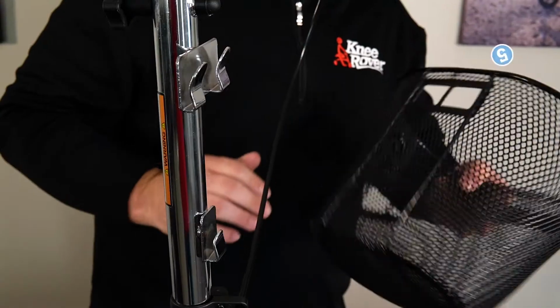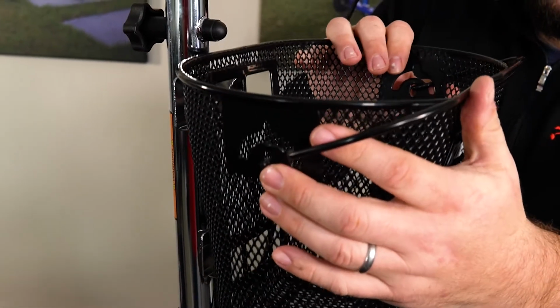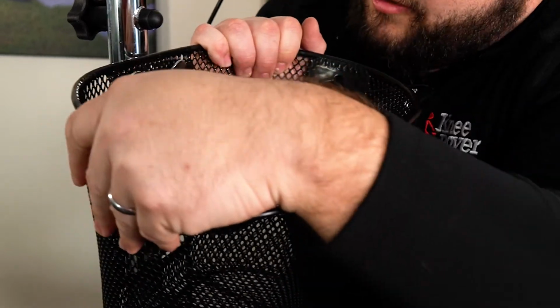All right, so step number 5, we're going to install the basket. To do this, we're just going to take it right here and put it on this bracket. Make sure you line the top and the bottom up. And then you're just going to push it down.